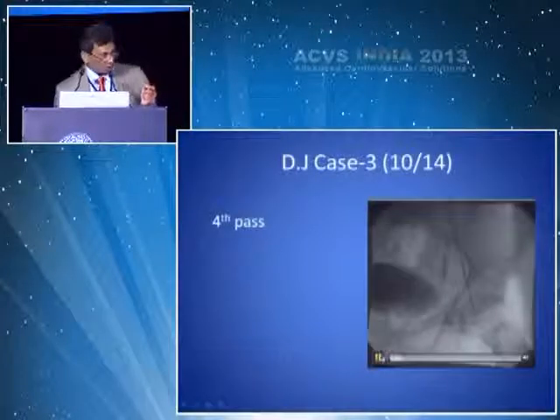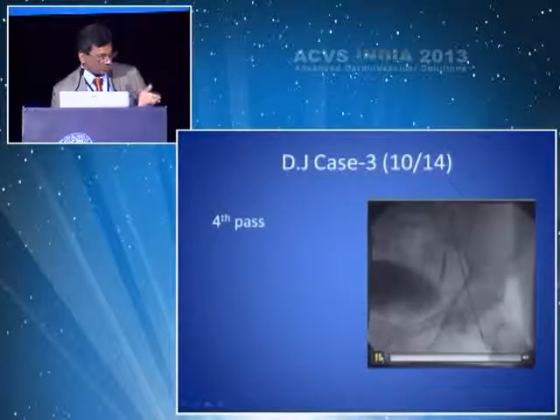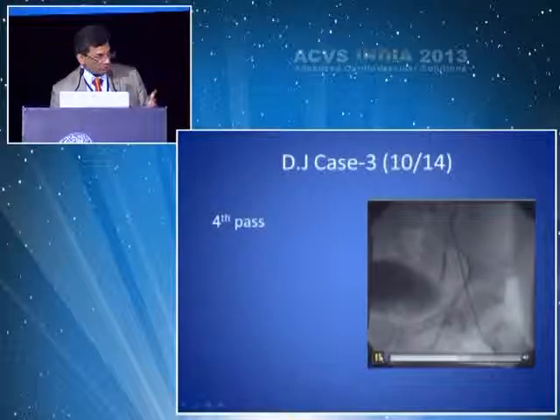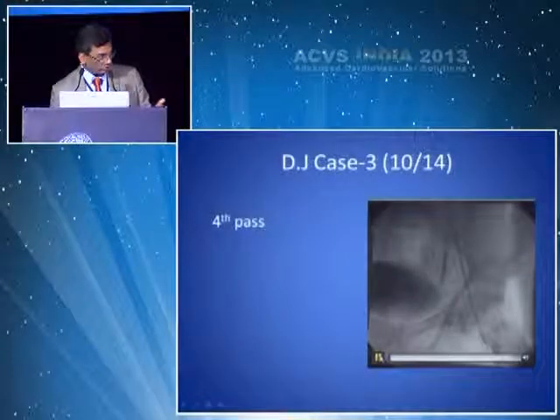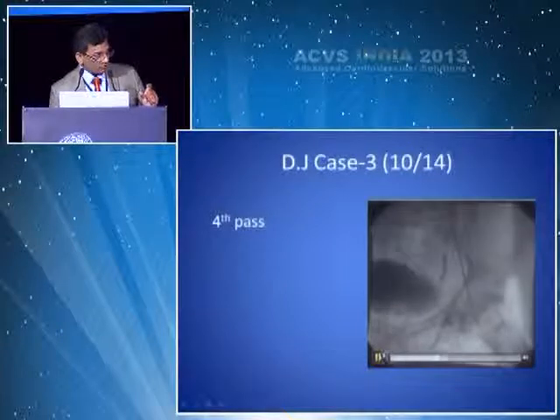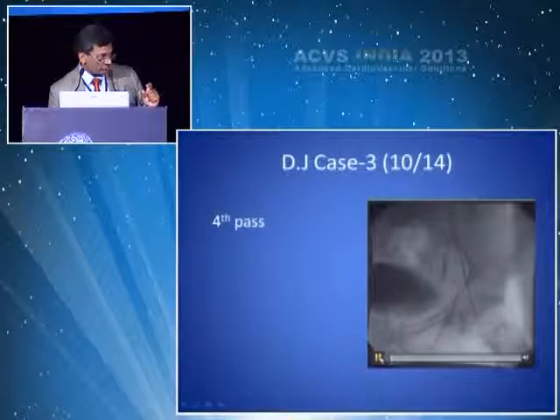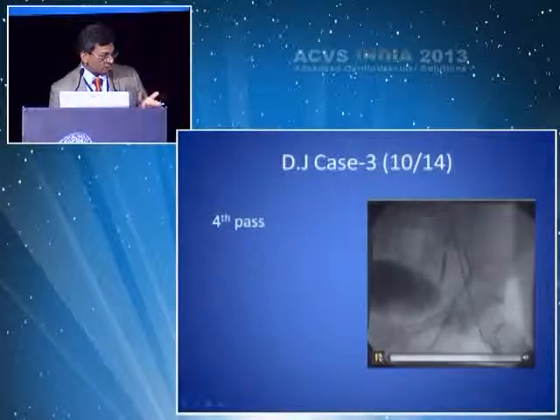How would you identify selective cutting? For example, if you have an inferior residual plaque left, is it a high risk to just try to go get that, and then you risk dissection or perforation? Silverhawk has a window that's very clearly visible fluoroscopically, like a little tray, and you can direct that.